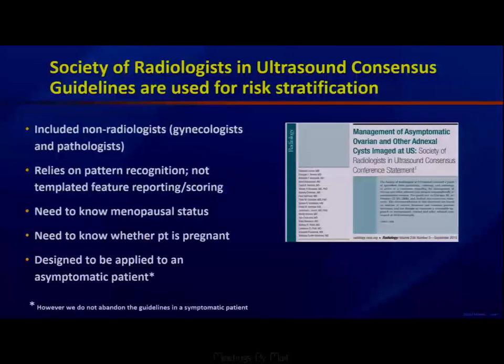So I'm going to use the SRU guidelines that published in 2010 from the 2009 Consensus Conference as a framework to move forward in reviewing these lesions. I want to make sure to recognize that we'll be seeing updates in a lot of the subsections of these guidelines even this weekend. We'll be hearing more about it, and I'll allude to that a little bit. But here I'm using it as a framework, not specifically to get into the nitty-gritty of every table, although I'll show some tables, but because this framework works so well for us in our practices. I think what's important to remember about the guidelines is that it did include non-radiologists, both gynecologists and pathologists, which lends it more weight and validity.